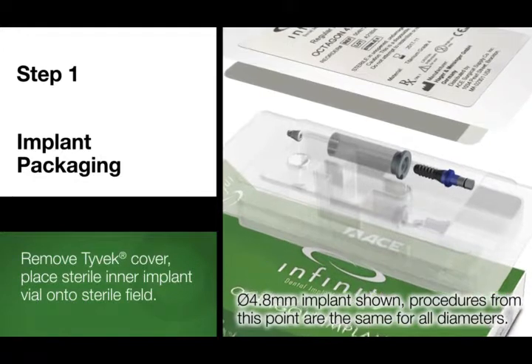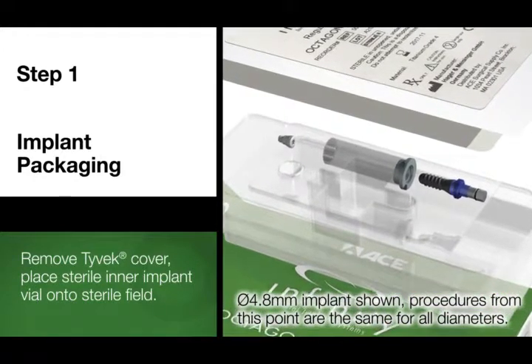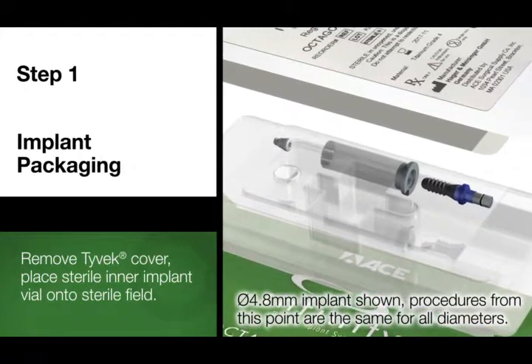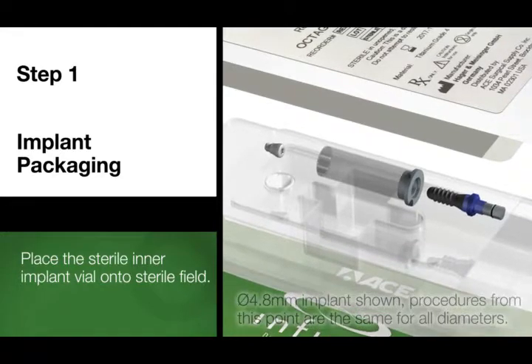Remove the implant blister package from the box. Open the blister package over a sterile field by locating and pulling off the sealed Tyvek lid. With the blister package open, drop the implant vial onto the sterile field.